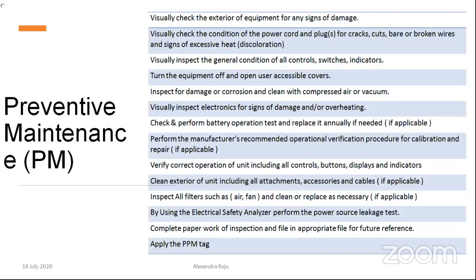So complete paperwork has to be done for future reference, like the previous preventive maintenance has to be recorded, and we have to apply the preventive maintenance tag to each and every equipment. That is all about preventive maintenance.